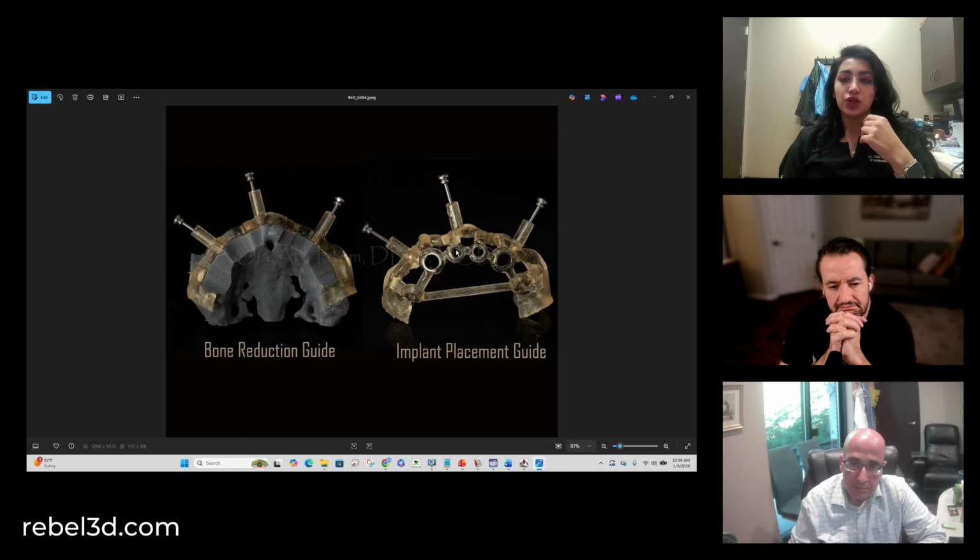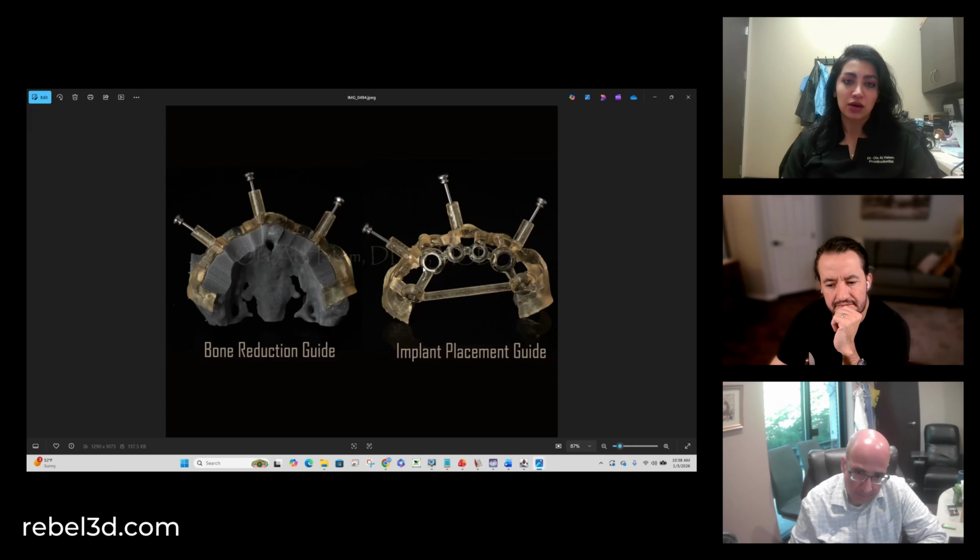Another issue is during surgery, if, for example, you are unable to get enough primary stability on one of the implants and you have to end up swaying from your surgical plan, positioning one of your implants a little bit more mesial or distal, unfortunately this isn't possible to do with a static surgical guide. In this example, we're showing swappable, not stackable guides. Same issues apply. You cannot change the plan on the spot. And this is why we're going to emphasize why dynamic navigation offers you so many advantages on the day of surgery, and before that, in order to keep your plan prosthetically driven all along.